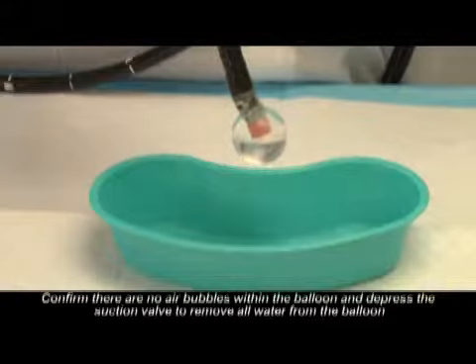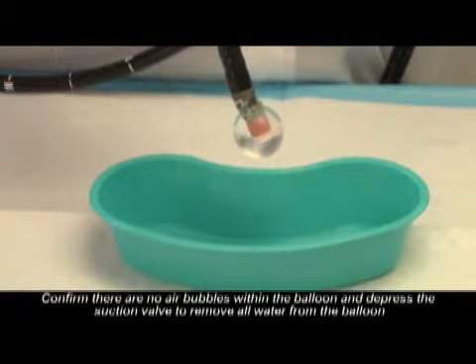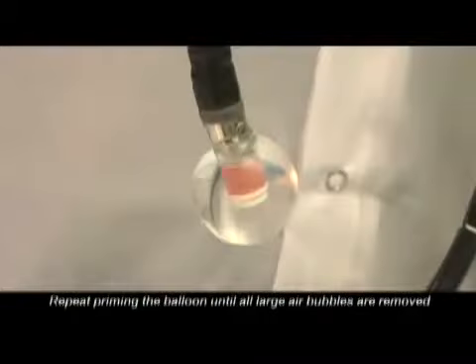Confirm there are no air bubbles within the balloon, then depress the suction valve to remove all air and water from the balloon. Repeat priming the balloon until all large air bubbles are removed.